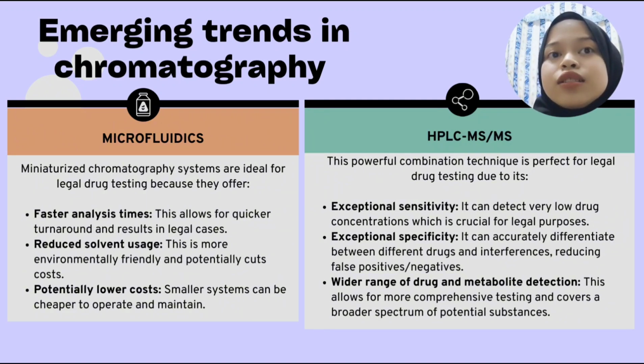Second, reduced solvent usage. This is more environmentally friendly and potentially cuts costs. Third, potentially lower costs. Smaller systems can be cheaper to operate and maintain.